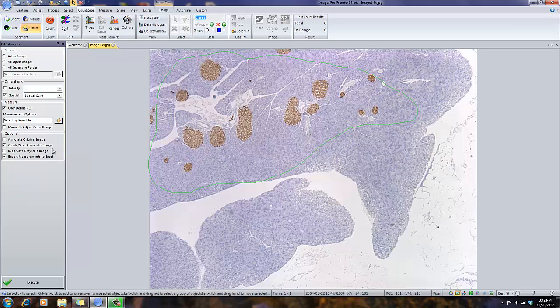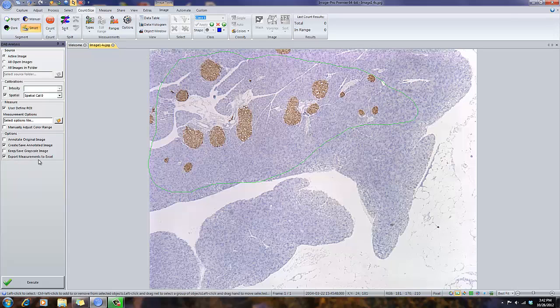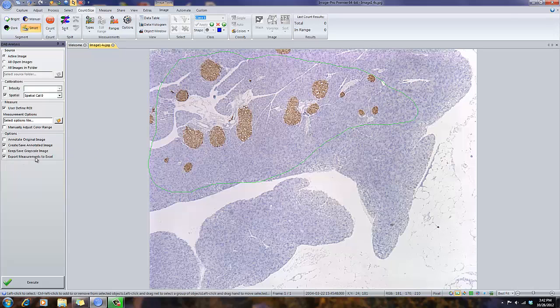I can also create and save an annotated image. We can also keep and save the grayscale image. And I can automatically export the data to Excel. For the purposes of this movie, I'm just going to create and save the annotated image and I'm going to export measurements to Excel.